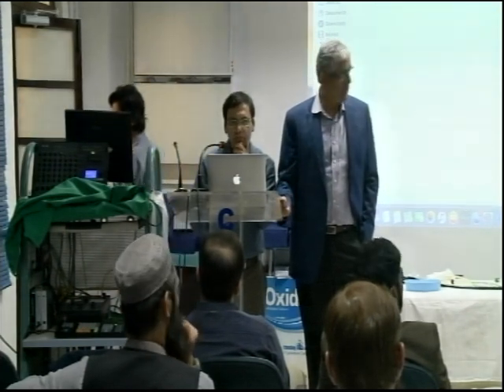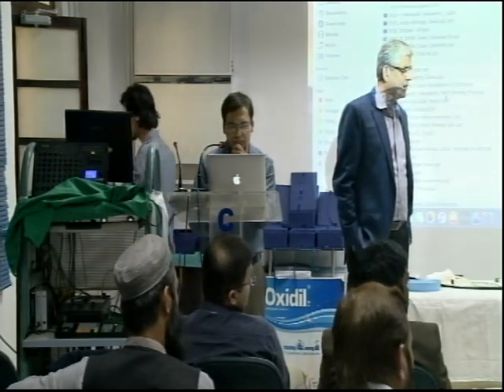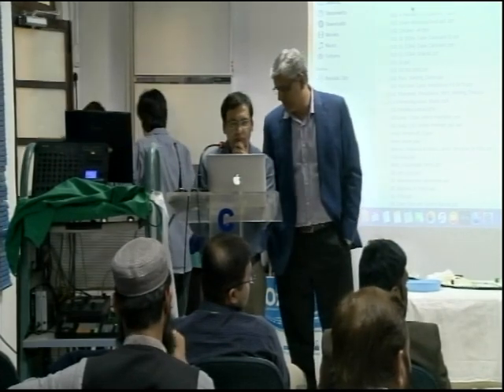Before I complete, I'd just like to make a few points. Number one, we did 16 cases over a span of 2-3 days, and you saw that it was 100% cannulation success without resorting to needle knife. So that's important. Secondly, whether below up or up down or whatever, it entirely depends on what you are good at. Do that. That's the rule for any procedure that you do. Do the procedure you are good at.